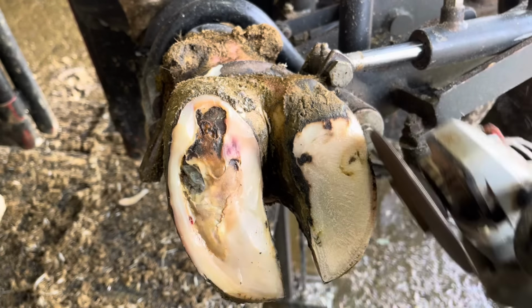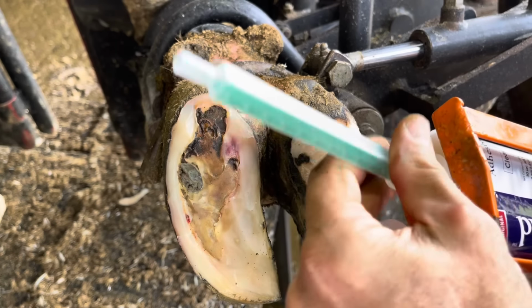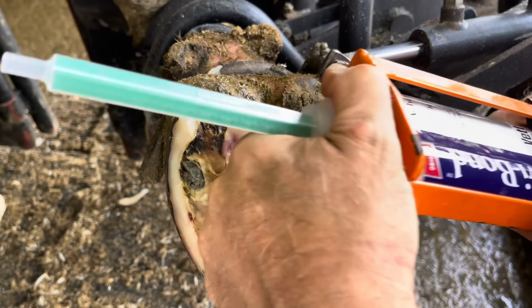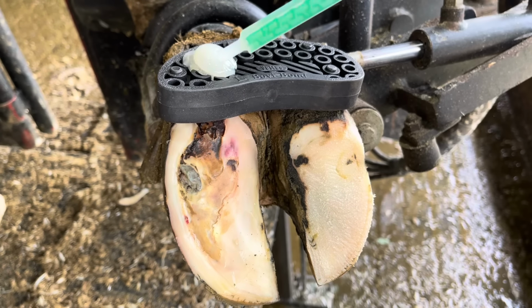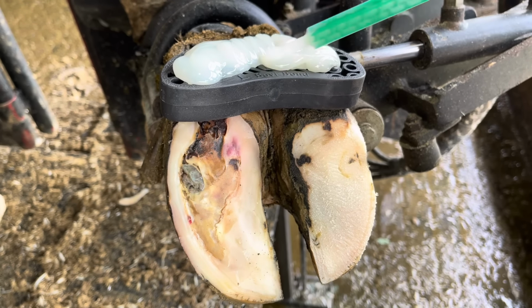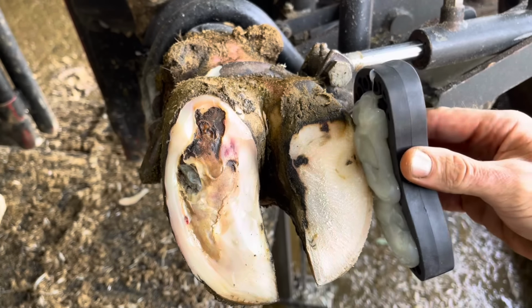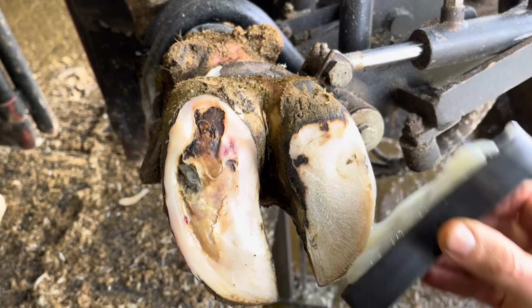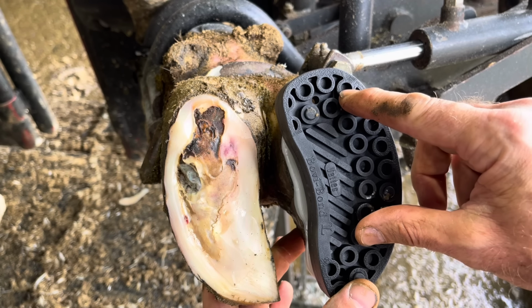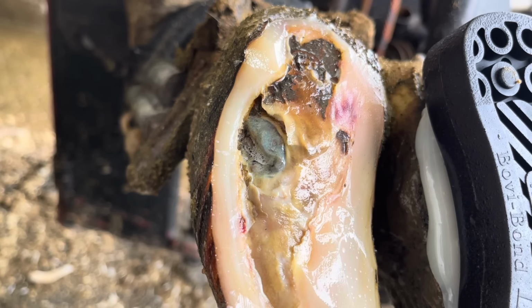Now, if you've ever wondered, what is that green thing that he sticks between the claws sometimes? That is just a used mixing tip for my block glue. It takes those two parts of that adhesive and mixes them together inside that tube, and when it comes out onto the block, that chemical reaction is beginning. I put that block onto the claw, and because those two parts are mixed now, that will firm up and become a nice hard surface for that block to stick to. But it's also going to firm up in that mixing tip, so I have to discard it.